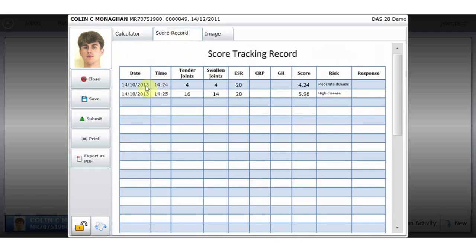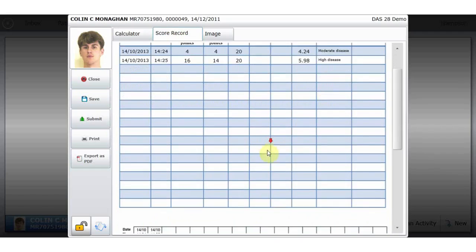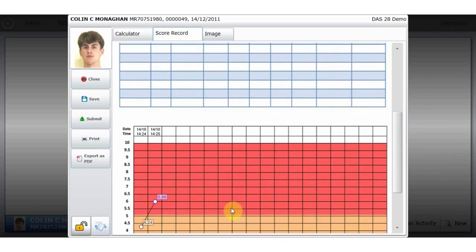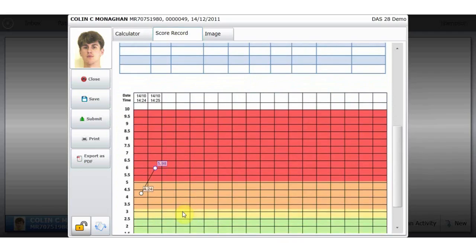As you can see, all scores that have been saved are kept on a score tracking record as part of a table, as well as a graph with each score date and time stamped.